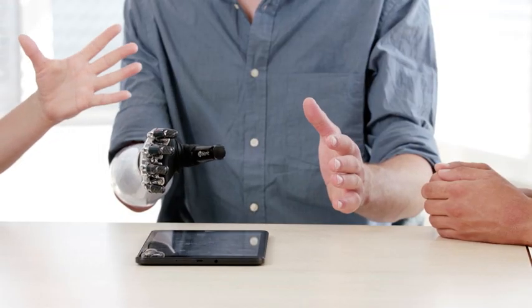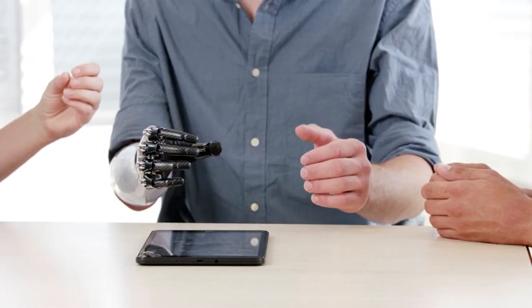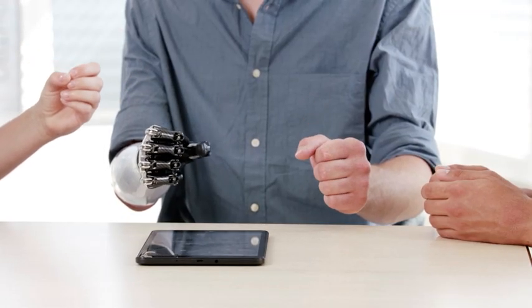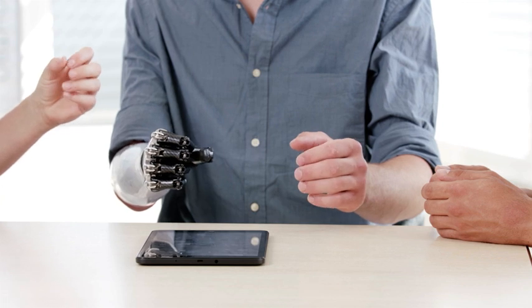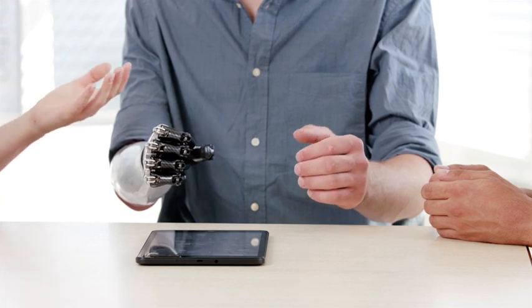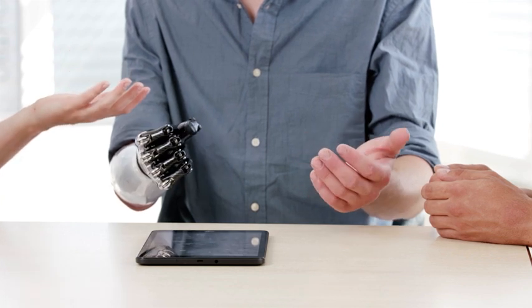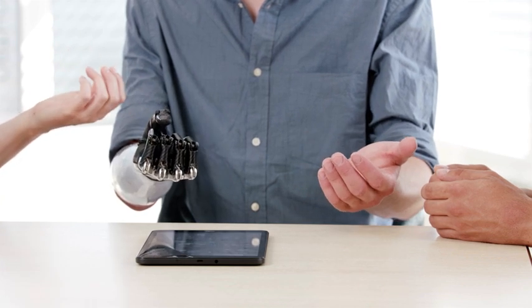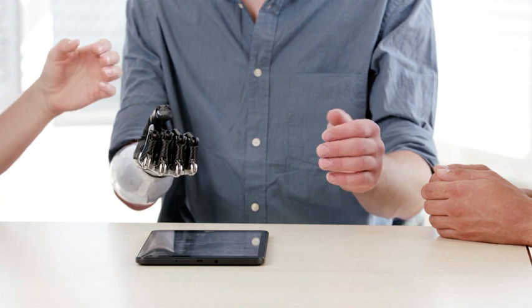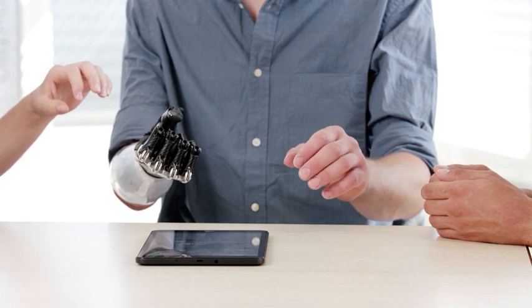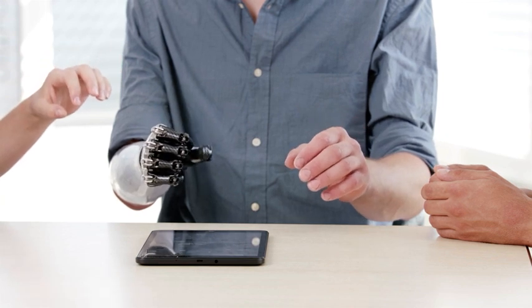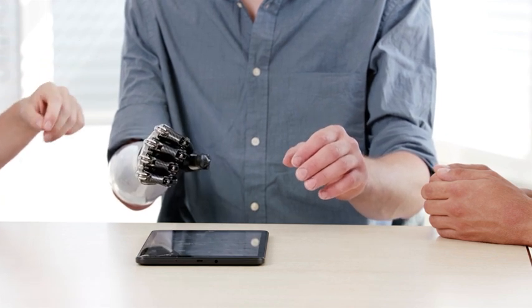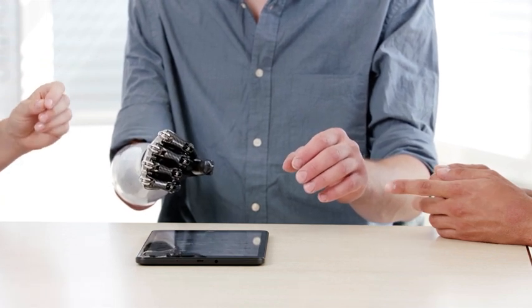Myo Plus provides the user with a significant increase to the intuitive control of their prosthetic hand. This is possible because Myo Plus learns how the user's phantom hand movements relate to the muscular activity of the residual limb.